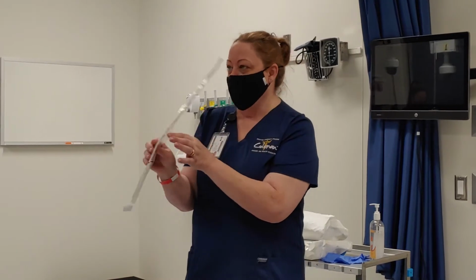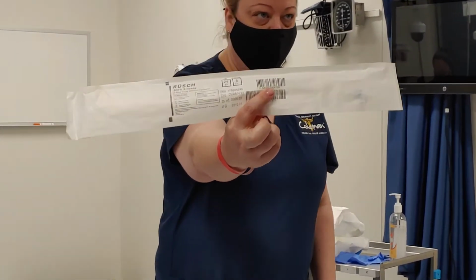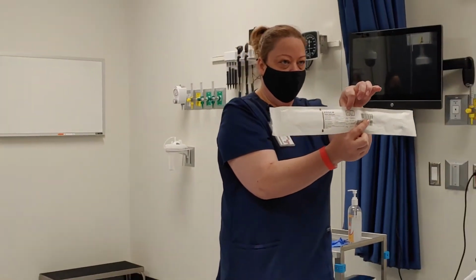So I'm going to send this around. This is just another example of a kind that we could use. Okay, and again, this is a 24 French, right? And you'll see the size right up there.